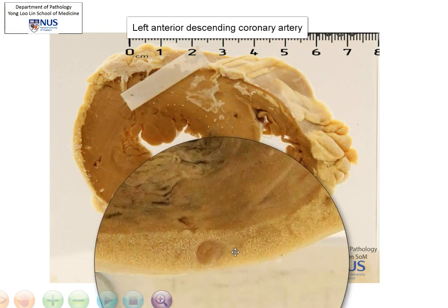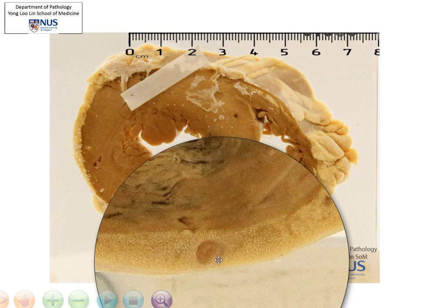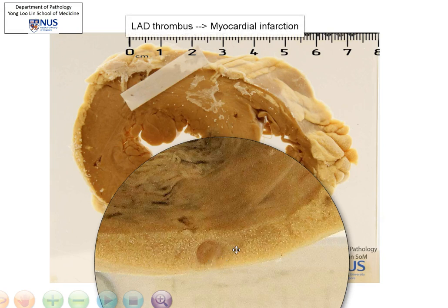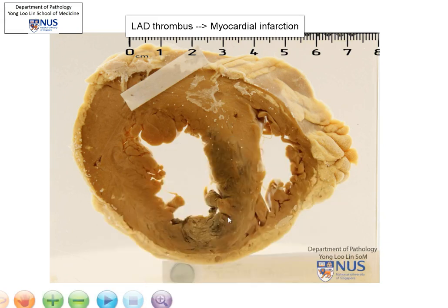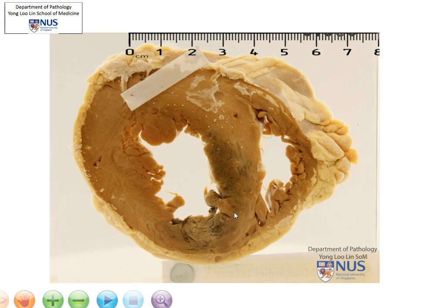I'm just going to magnify this area. If you look at the vessel, you'll see that it is not patent. What the vessel contains is a thrombus. A thrombus is the formation of a clot within an intravascular space. So this is an example of thrombosis of the coronary artery that is leading to myocardial infarction.